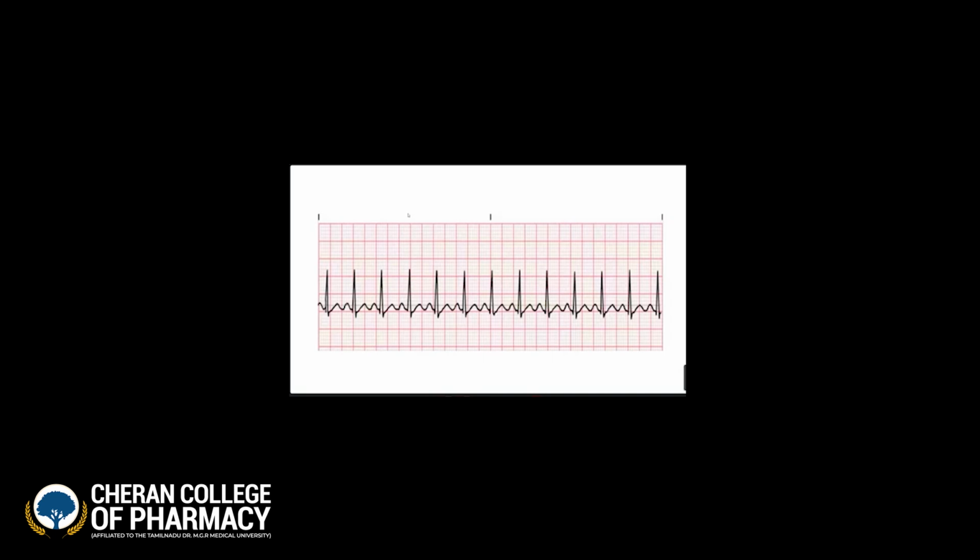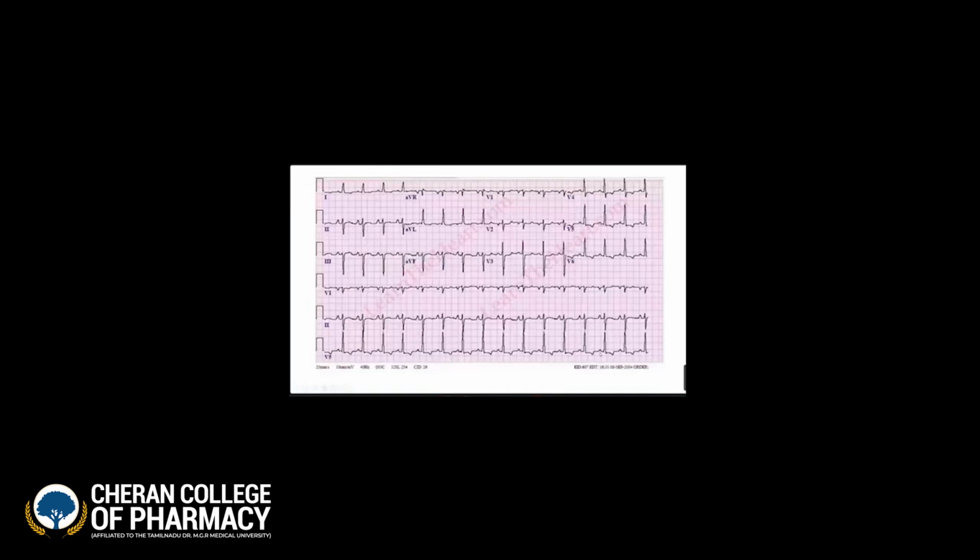So this is the basic understanding about the heart rate, and the actual range a normal person maintains. But yes, 60 is a little bit slow only, but below 60 is bradycardia. Okay, below 60 is bradycardia. So this is the regular rhythm counting method. Everyone can see the ECG?